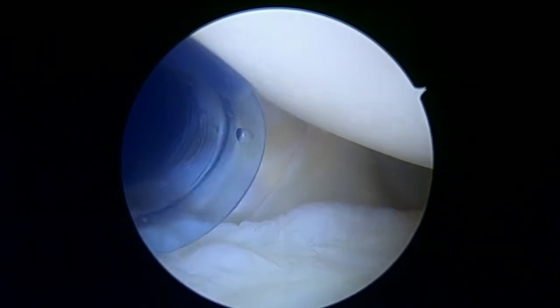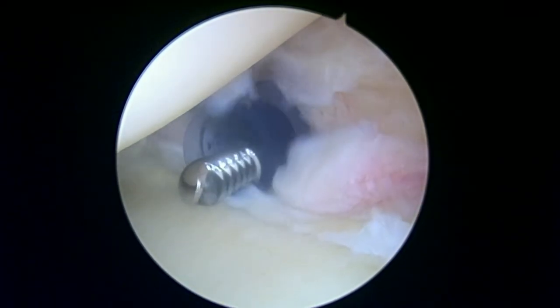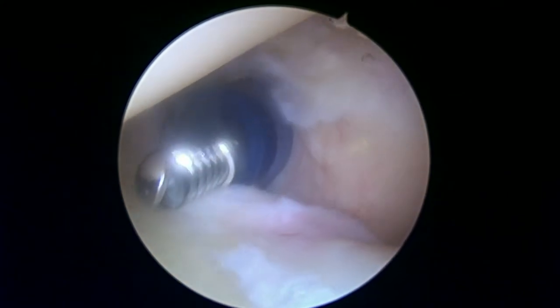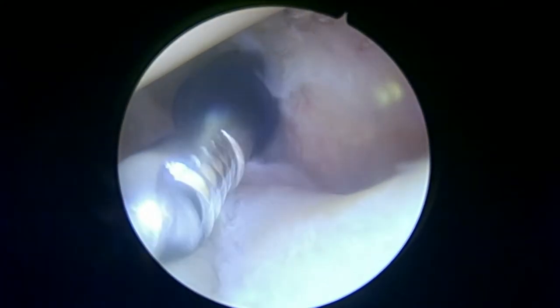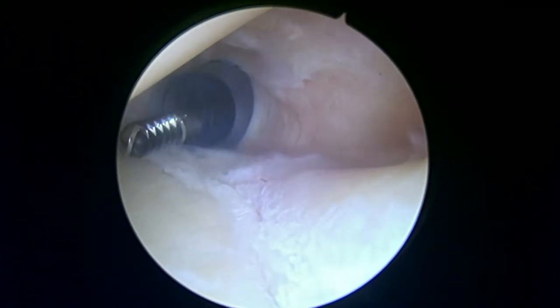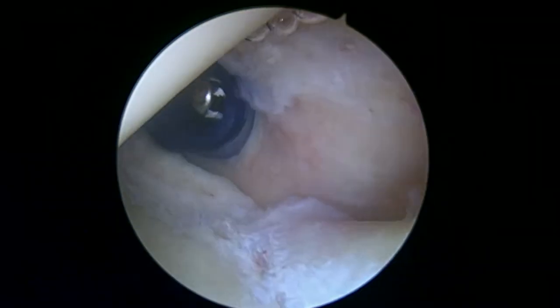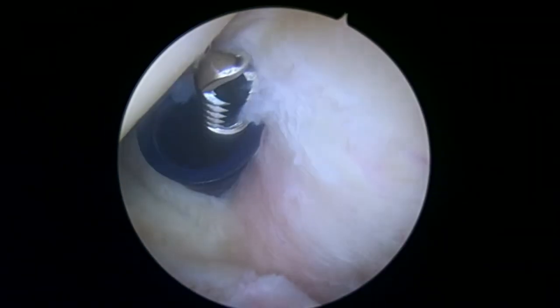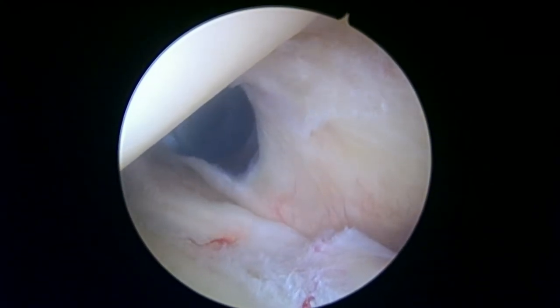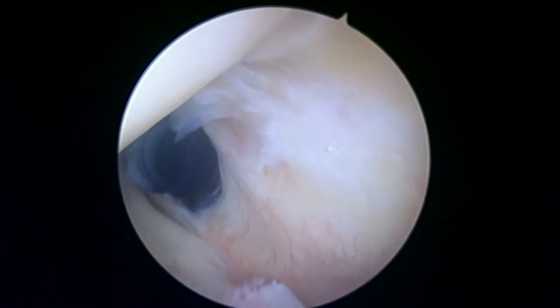Two switching sticks, please. Okay, so now we're looking from the front to the back. This is the posterior aspect of the joint. This is posterior labrum. I think that's going to be okay. Can you get a hi-fi suture shuttle relay also? We're going to pass a provisional marker stitch across this here.